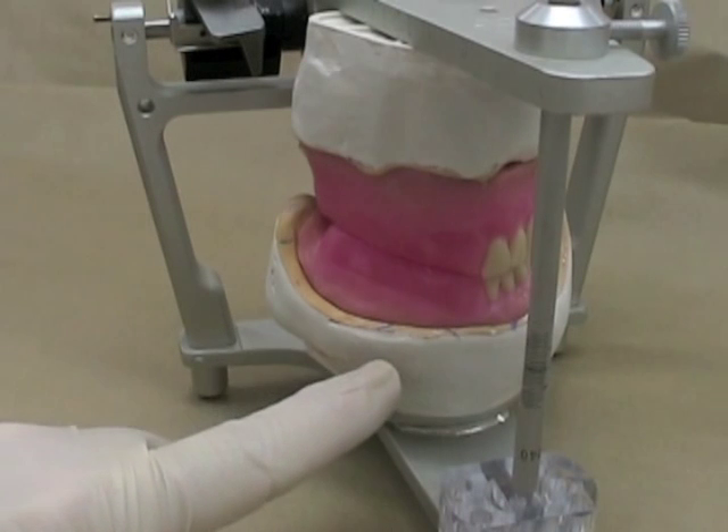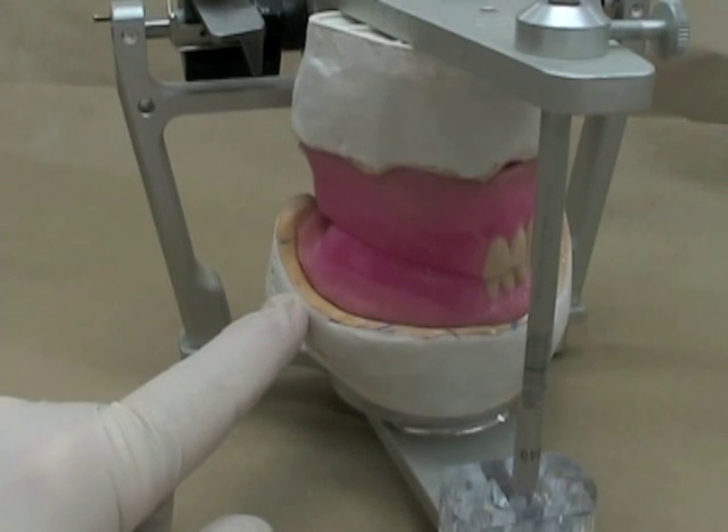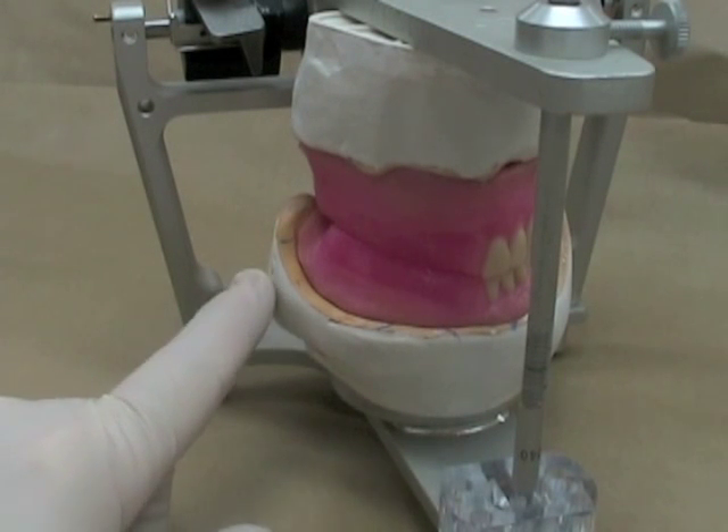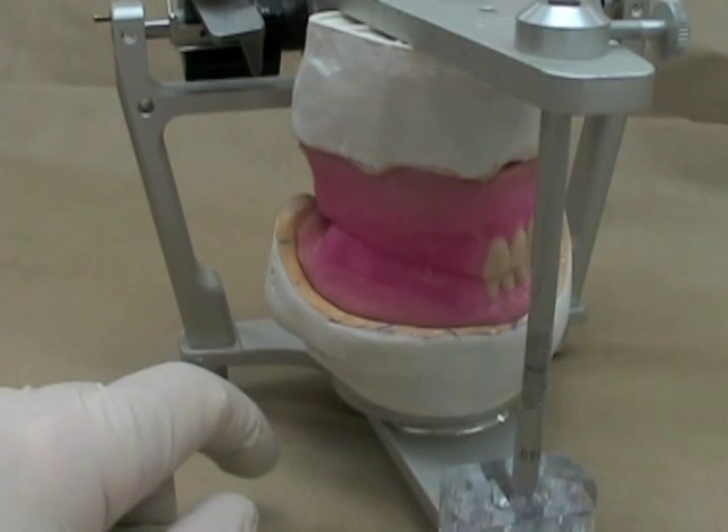For this exercise, you'll notice that I have mounting stone over the sides of my cast. Clinically, you never want to have that happening. You want to make sure that your mounting stone ends at the base of the cast. We've just tidied that up for appearances for this particular video.